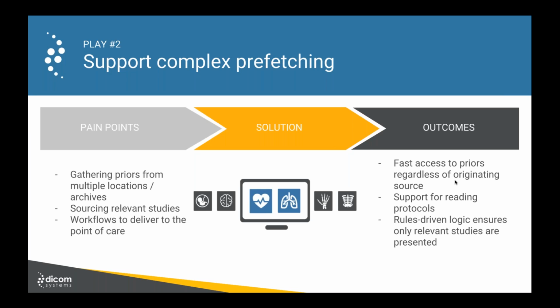The thought behind that for us was disk is not that expensive, and this is certainly before Tomo existed, so keep that in mind. But disk is not terribly expensive, and if we have a prior image inside of our PACS, it allows us to provide an improved service level versus us having to continually prefetch it over and over again. So we chose to store those images and retain them. And where we can't, we use our PACS platform, our VNA, to delete, upon the rules set by the client.